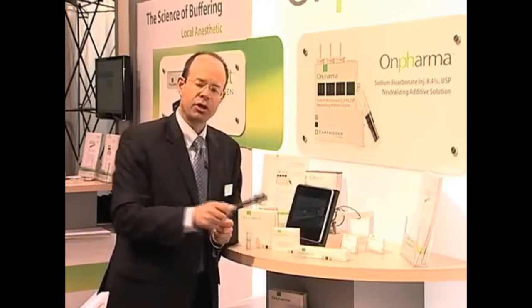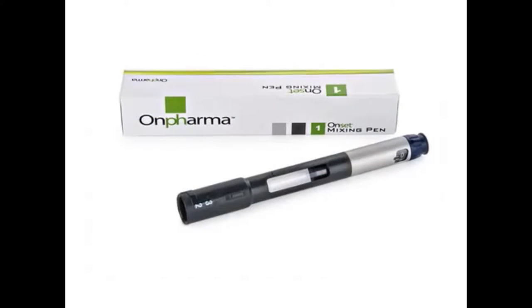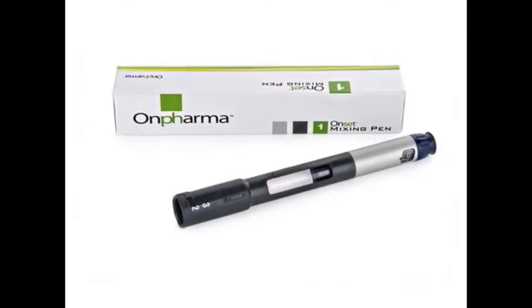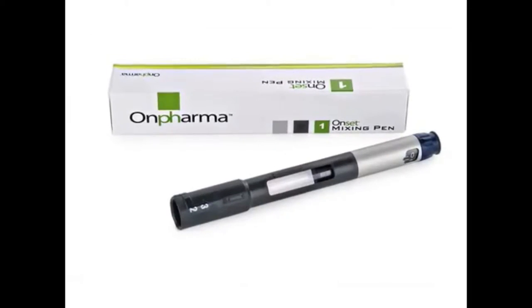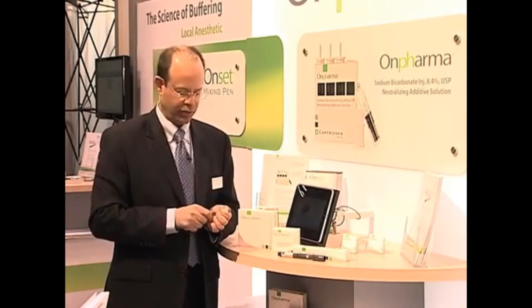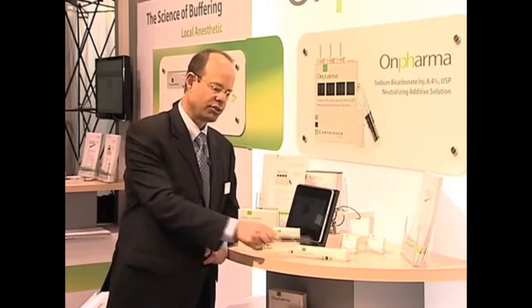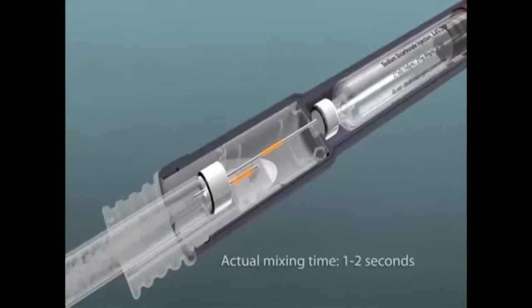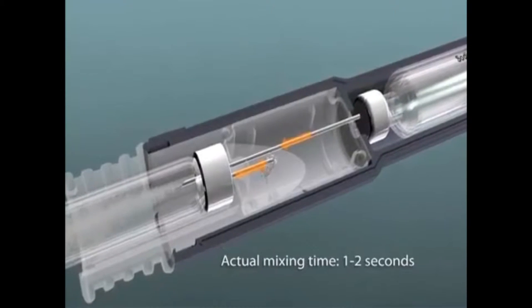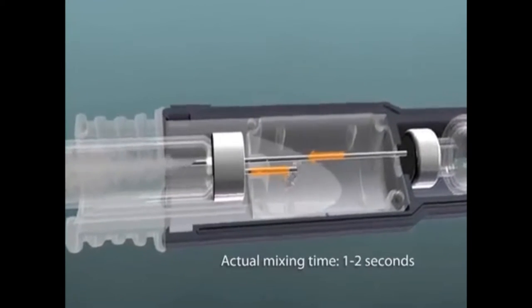We then needed a compounding device — a way to get sodium bicarbonate into our anesthetic cartridge. This is our mixing pen, which is a compounding device that allows us to do that. It's a very precise device that controls for a number of variables that needed to be controlled for. The final thing is a conduit — a cartridge connector — that allows us to go from the cartridge of anesthetic to the cartridge of bicarbonate. All of this comes together with our mixing pen, sodium bicarbonate loaded into the mixing pen, and the cartridge connector.